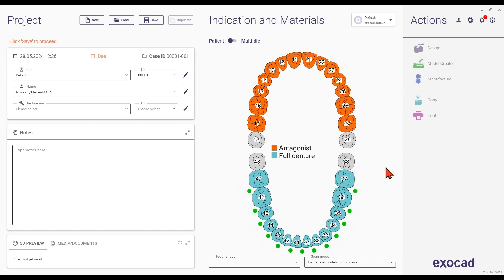For this tutorial, we will focus on tooth positions 45, 42, 32, and 35, which are implant-based.